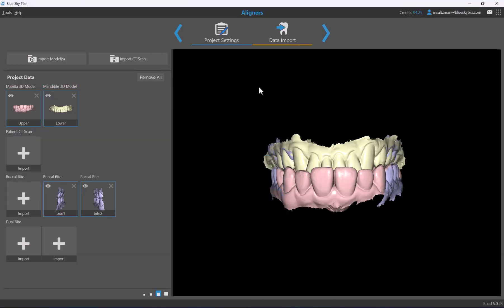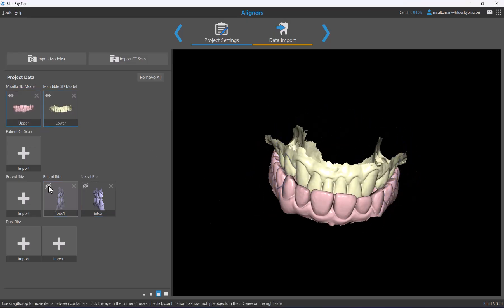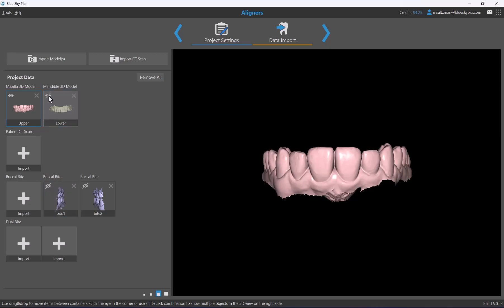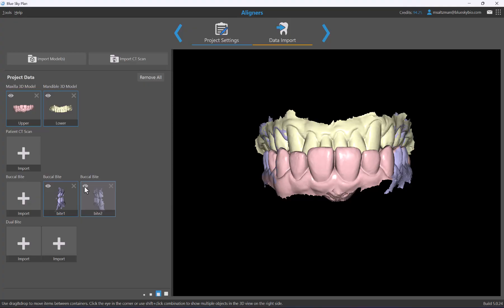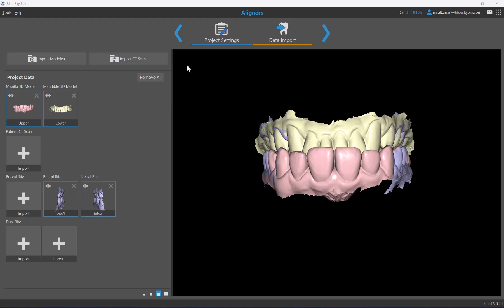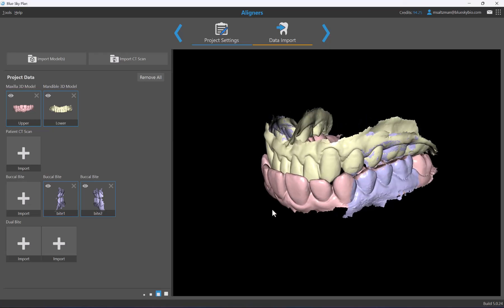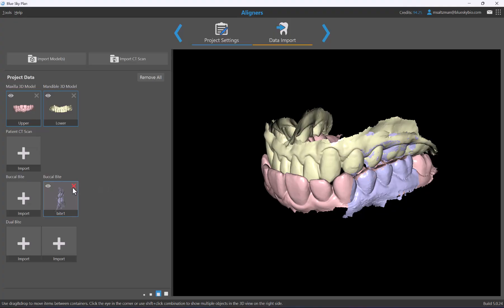On the left side of the screen are previews of your files. The software automatically identifies different file types and places them in the relevant categories. You can preview them on the right side and toggle visibility on and off. Importantly, the flow of the case will change based on what you import — if you import buccal bites, the software will run through steps to articulate the upper and lower models based on those bites.